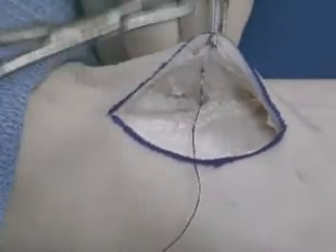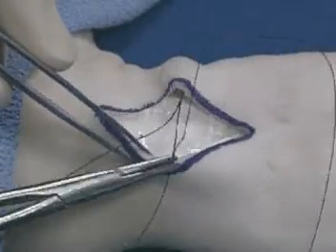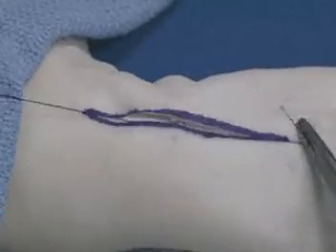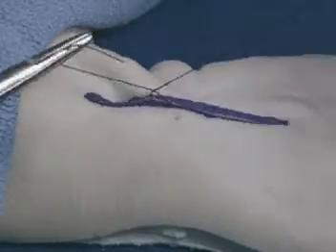The first suture that is placed is a deep suture and it is buried. It is placed in the dermis at approximately the mid portion of the incision according to the principles of halving. A surgeon's knot is used to close the deep tissues, thereby approximating the wound edges.